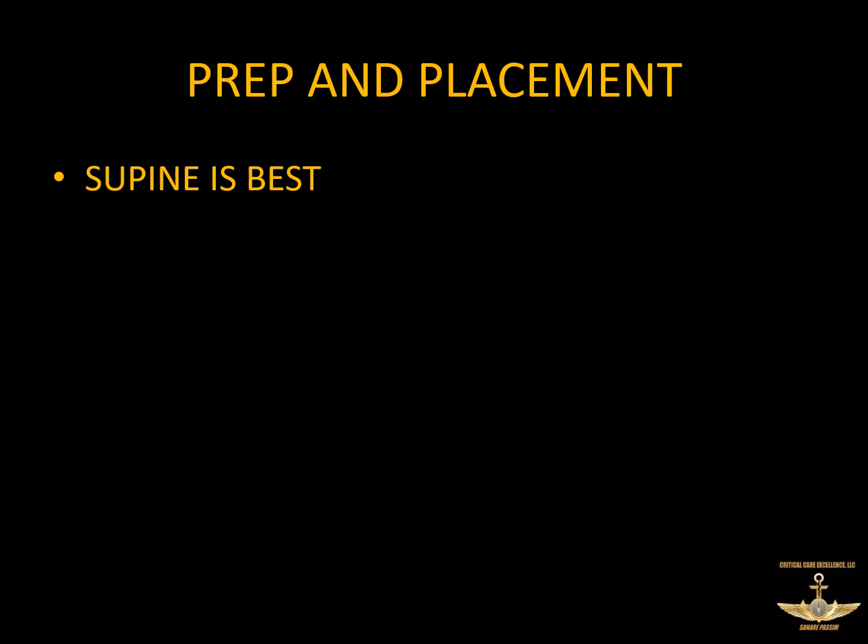So, now that we've talked a little bit about our anatomy, we then need to know how to best assess the heart based on those things, and that gets us into how we actually do the 12-lead EKG. Now, the first thing I want to explain is that what we're going to talk about here, our electrode placement, is how to do a 12-lead. That's a diagnostic procedure. And our diagnostic procedure is going to be how we assess things, not only like rate and rhythm, but how we're also going to assess things like ST elevation, ST depression, QT intervals, and things like that.